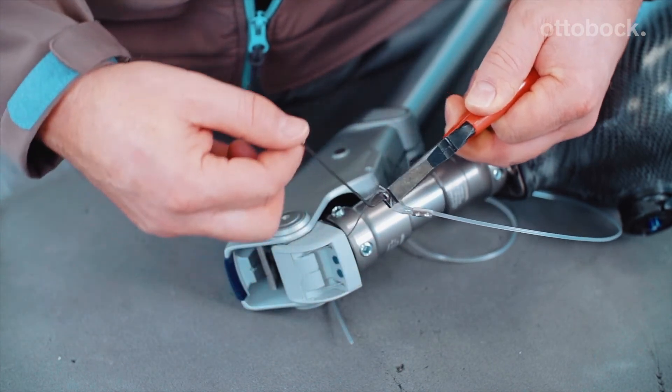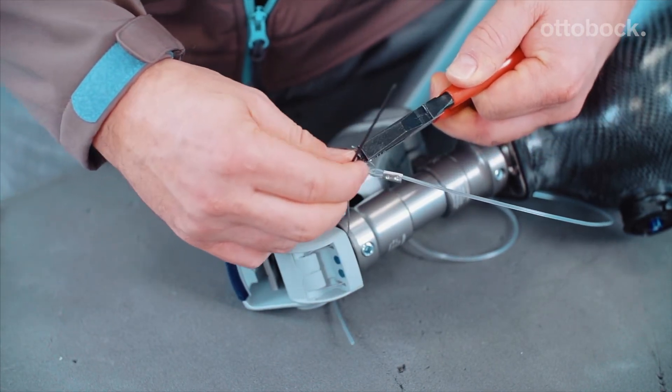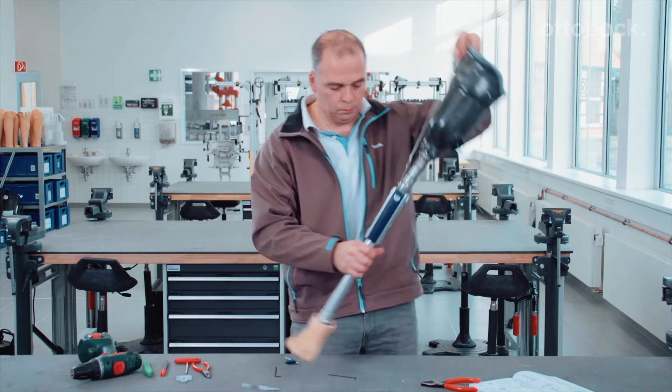Please use the allen key to tighten it. The screw must be tightened with the correct torque.